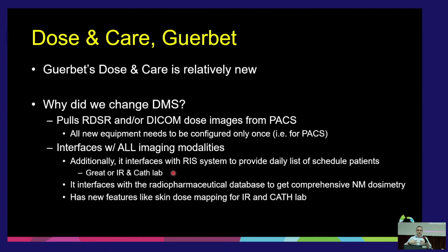It'll show you the dose map, the skin map. So if they did a procedure a couple of months ago or a couple of weeks ago, they will see the total skin dose, which angles and all the different positions, and how the dose was distributed over the skin. We encourage our interventionalists to look at that, and that helps them in case they say, oh, this patient's had a lot of dose over the last couple of weeks or months. Maybe we should plan to come in at a different angle. It just helps them to understand. So when they walk in to start using fluoroscopy, they already know in the back of their head how much the patient's skin has received, so they don't have to worry about skin effects later on.